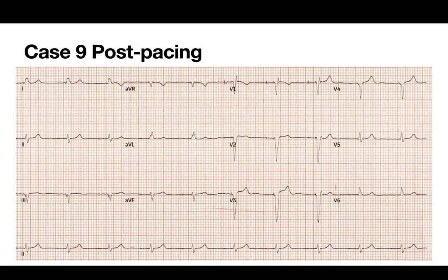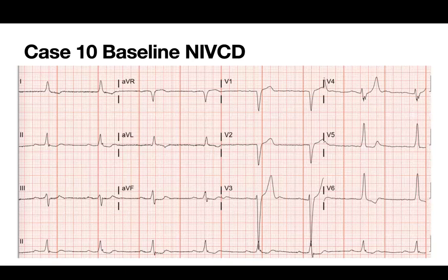Okay, we'll go to case 10. This is a patient who has a non-specific intraventricular conduction delay, even looking at baseline V6. He had a combination of sinus node dysfunction, syncope, prolonged QRS, EF about 50%. He has had a previous MI and a lateral scar. This one doesn't have the typical Strauss criteria, and I knew going in that I'm not going to have a great LVAT.